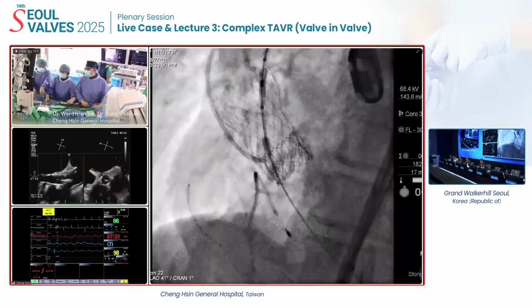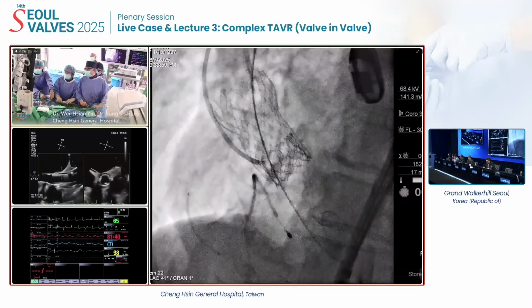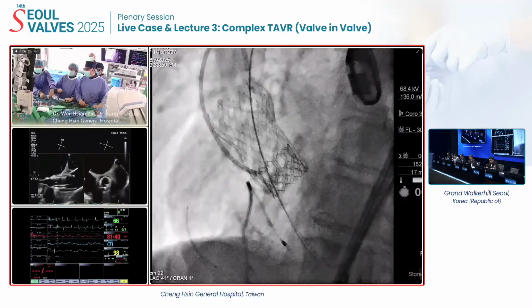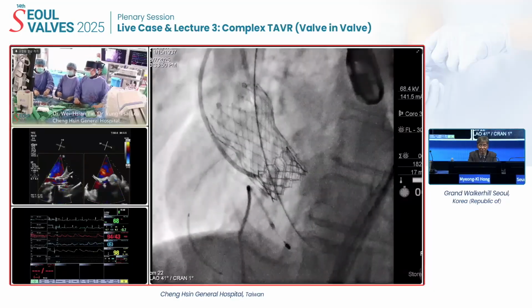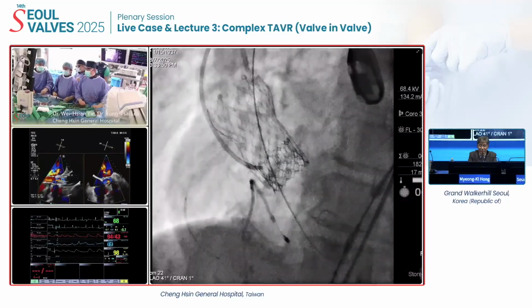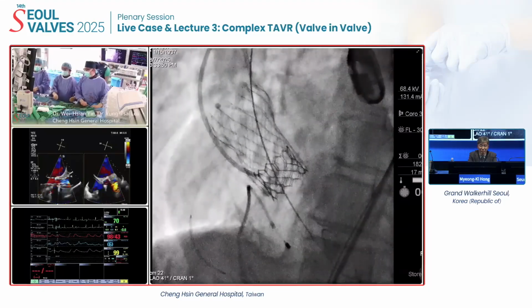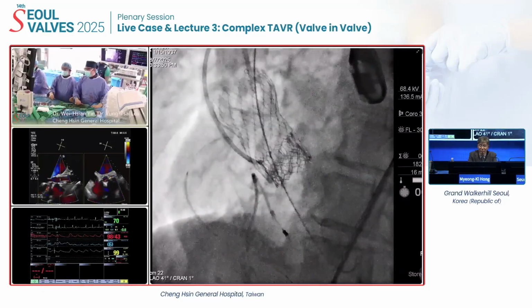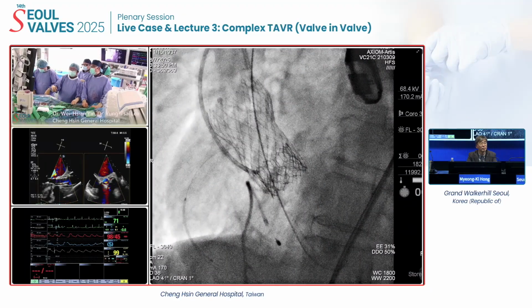Let's see the final step to determine whether we should stent the right coronary or not. Okay, please play back.